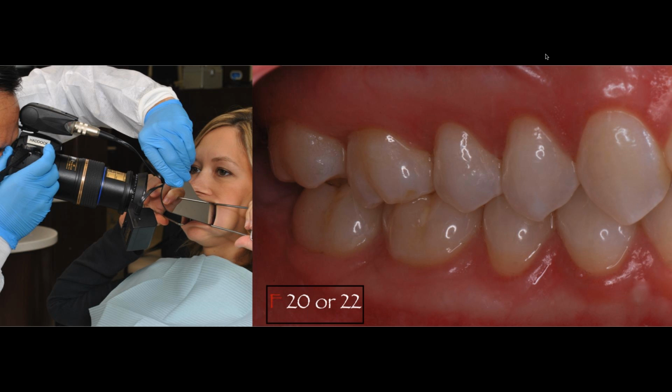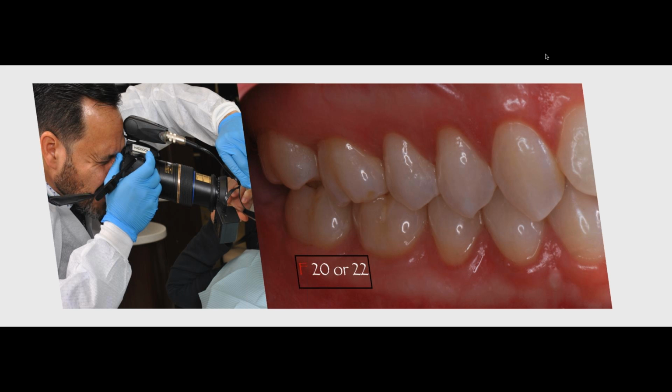And this is the opposite side. Now, the opposite side, in this case for me, is her right side. I'm left-handed, so you can see that my hand is now going on top of the camera. So your opposite side is always going to be the most difficult photo for you to obtain. You just have to practice, and probably you're going to take more than one photo for the opposite side, because obviously it's a little bit uncomfortable to have your arm on top of the camera and at the same time hold the camera. But as you can see here, it's doable.